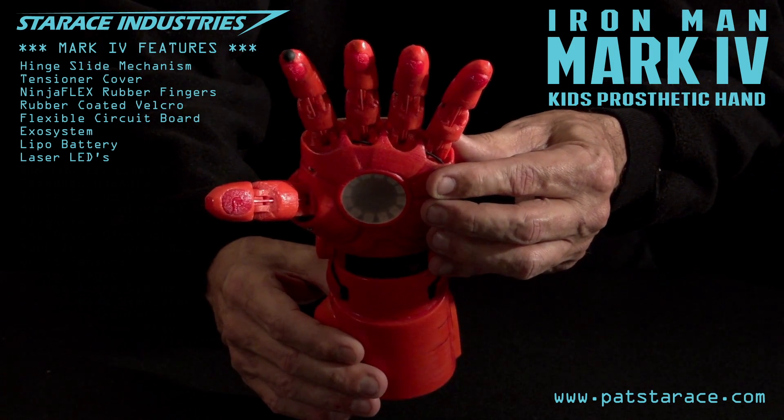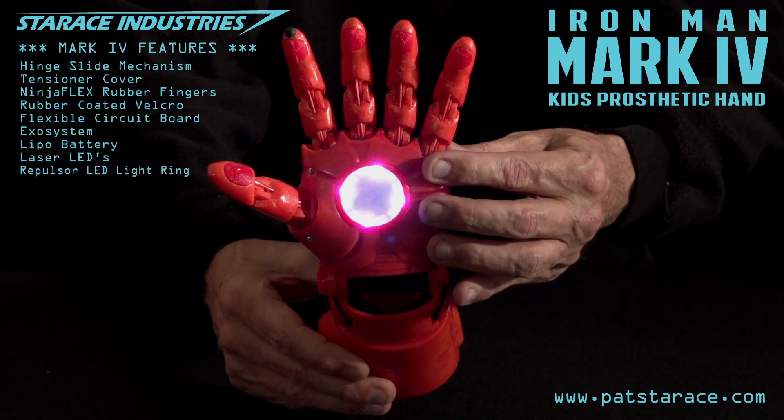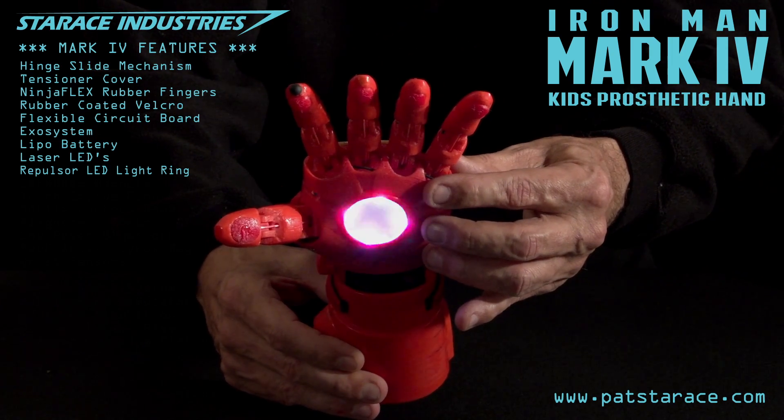Okay, activate hand controls. Start off easy — 10% thrust capacity. Repulsors activated. I've also prepared a safety briefing for you to entirely ignore. Repulsors on. Repulsors off.